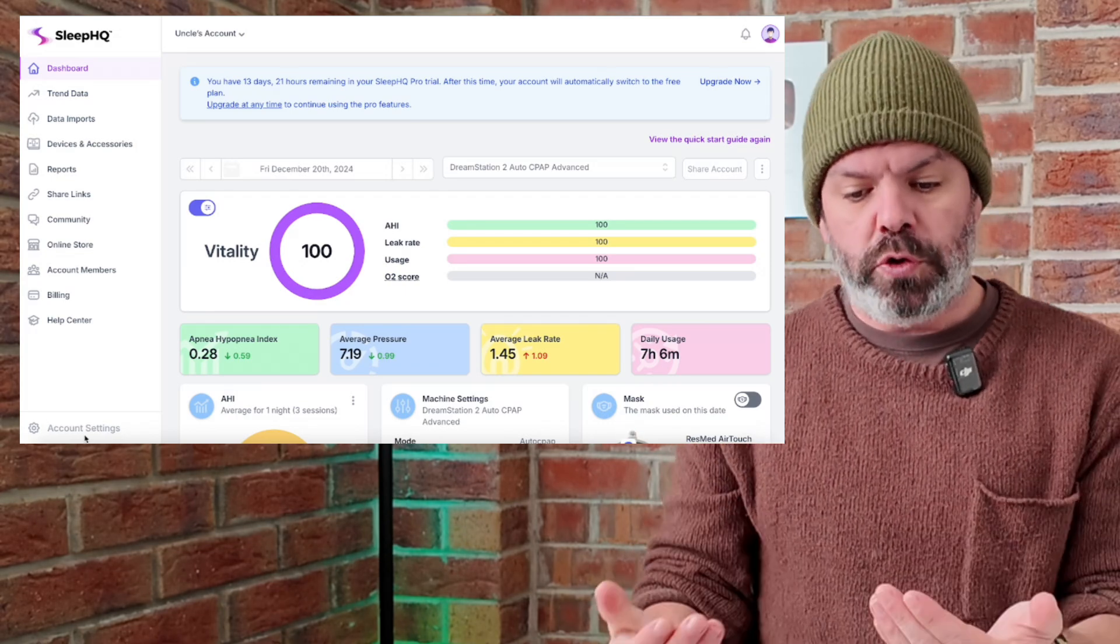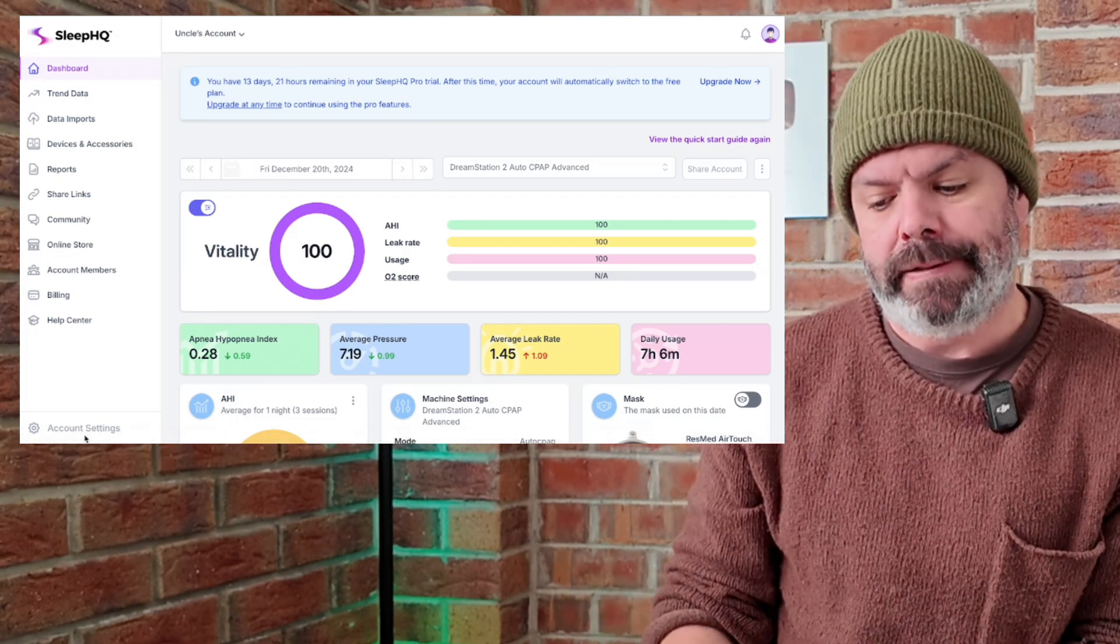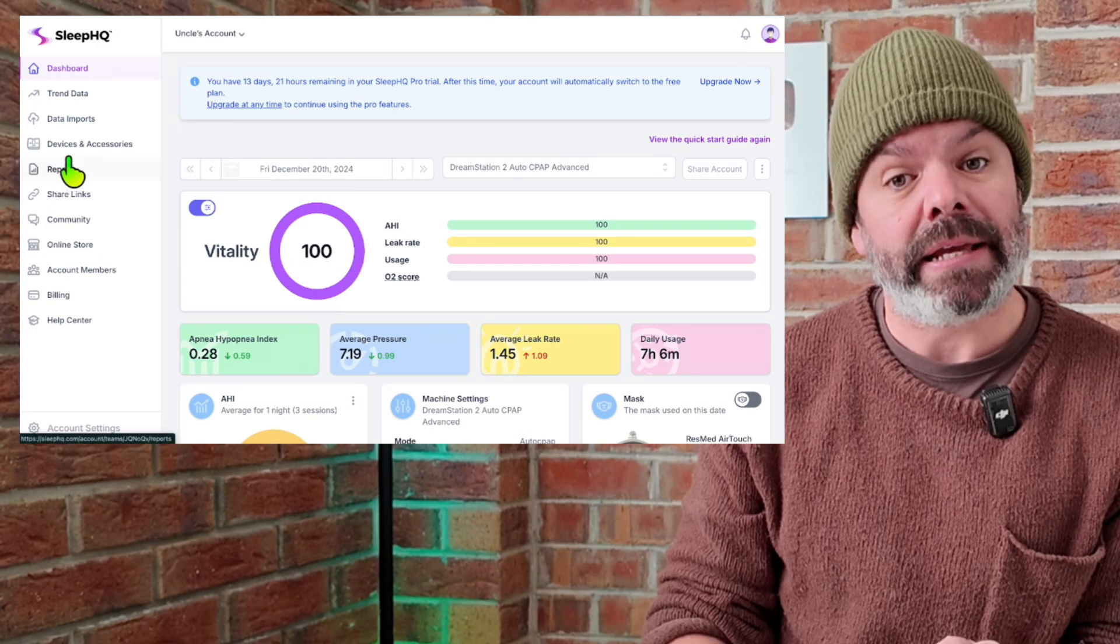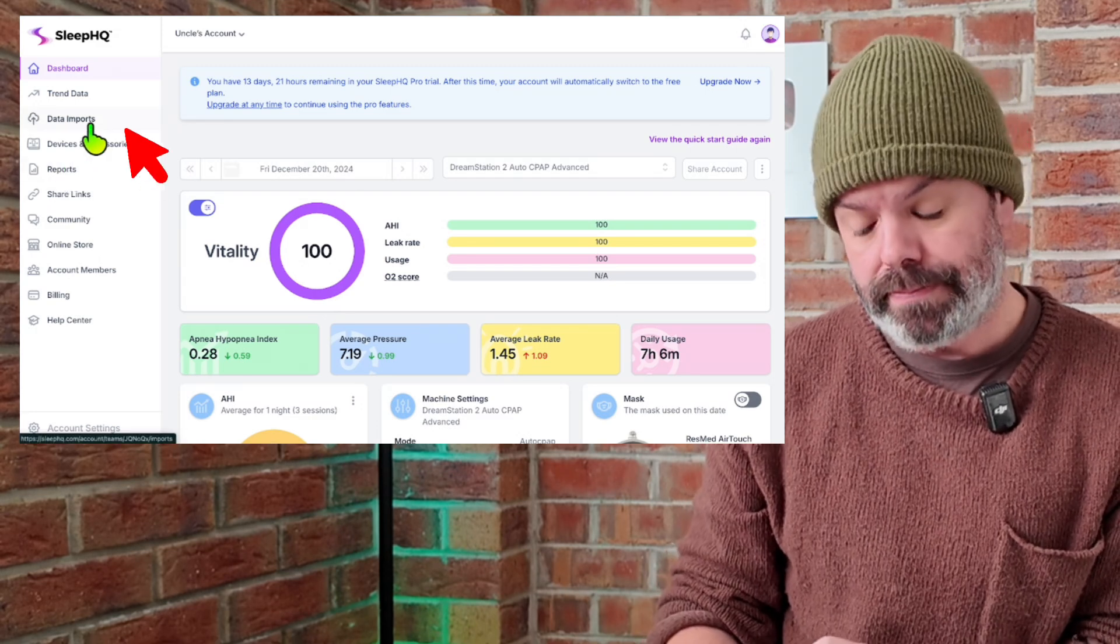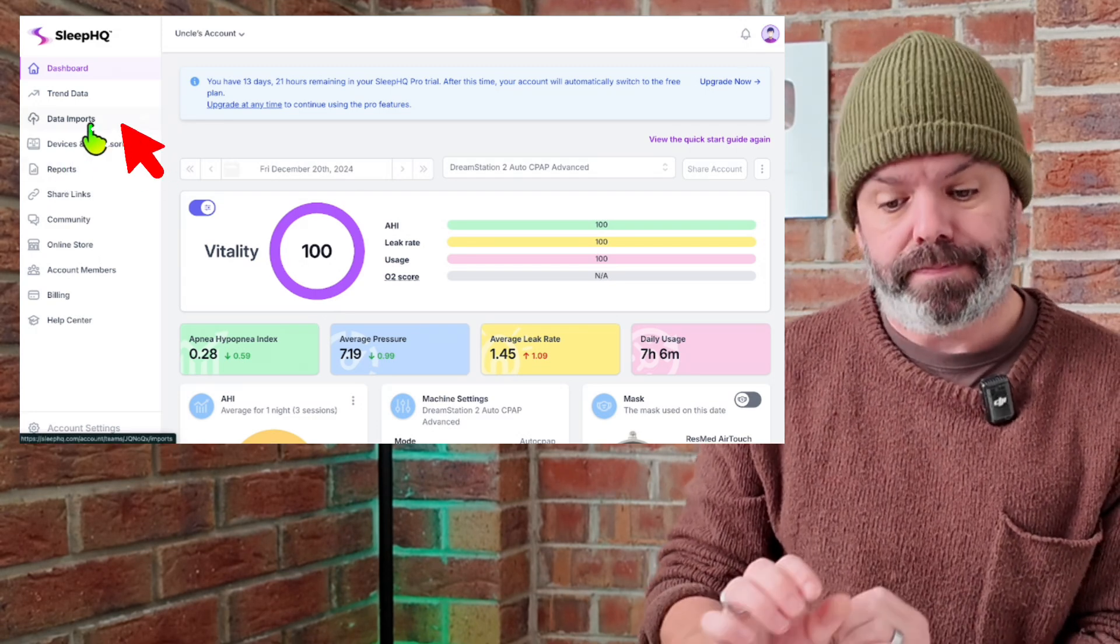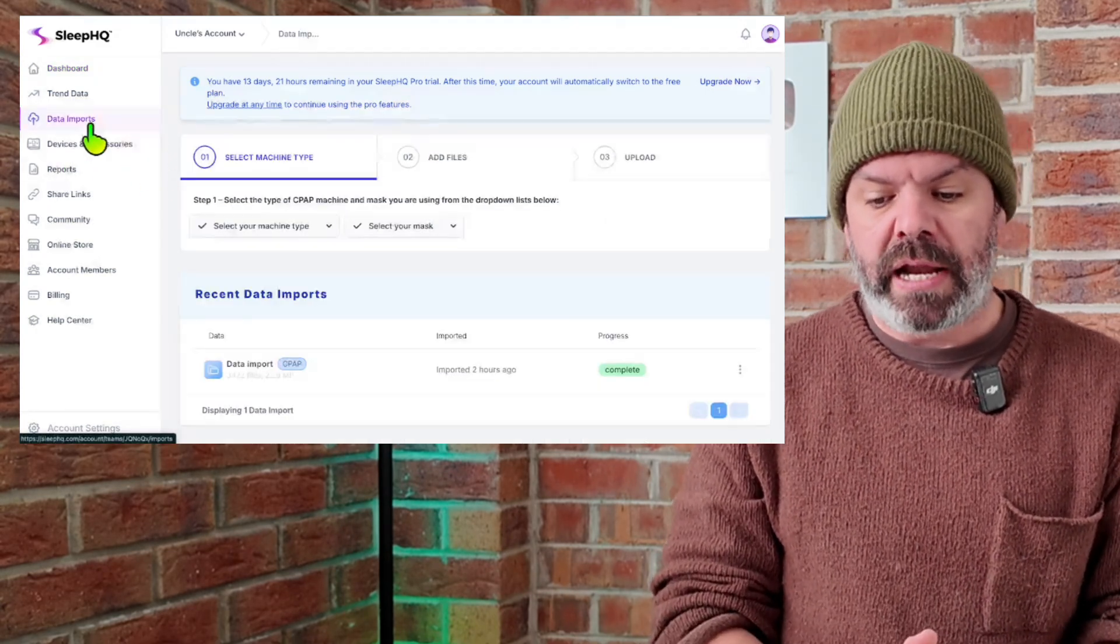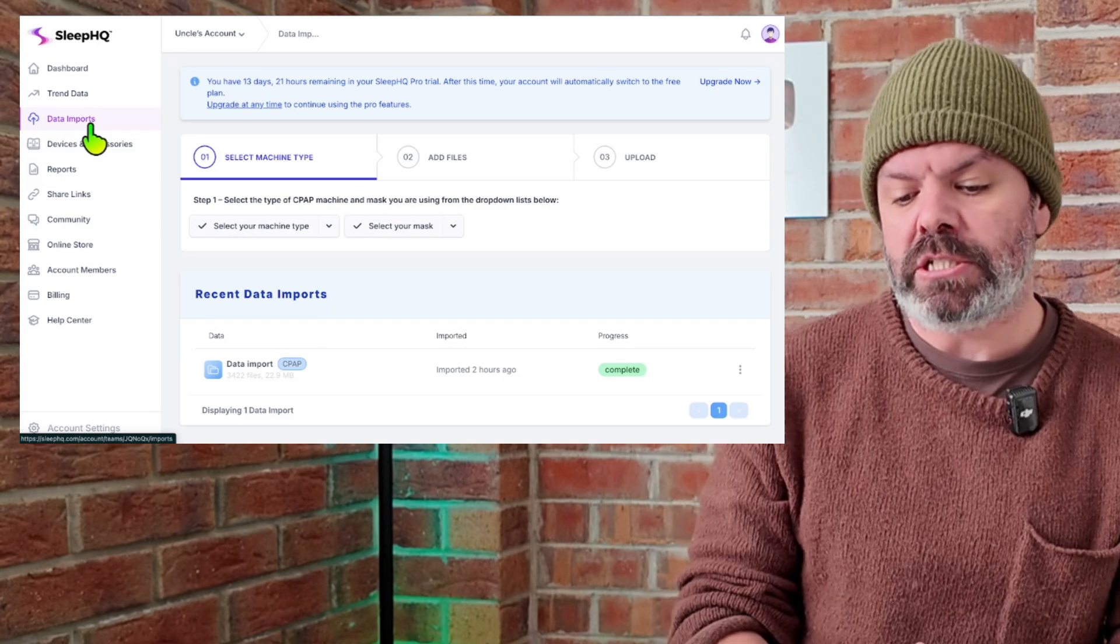Now when you join, you'll come over here to Data Imports. We'll visit the Data Imports page.